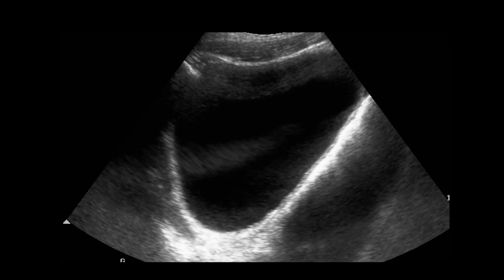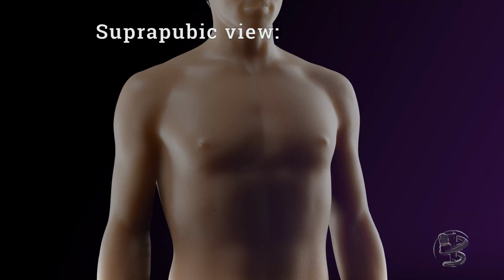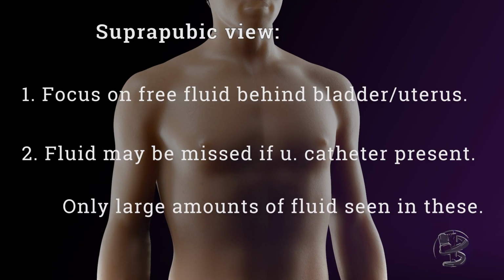Enough with artifacts, since we covered this in the physics of ultrasound lecture. We need to focus our attention on the presence of fluid behind the bladder or the uterus. Free fluid in the pelvis can be missed when a urinary catheter is placed, compromising the acoustic window for the suprapubic view.